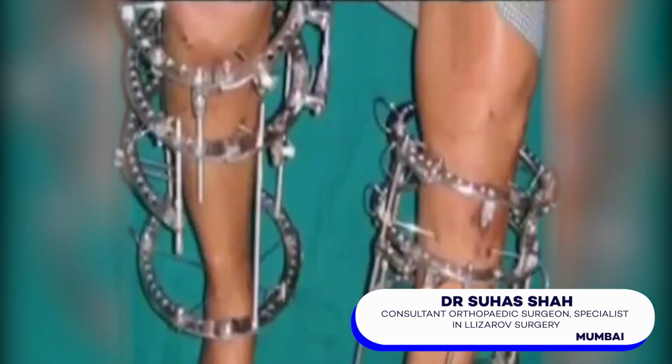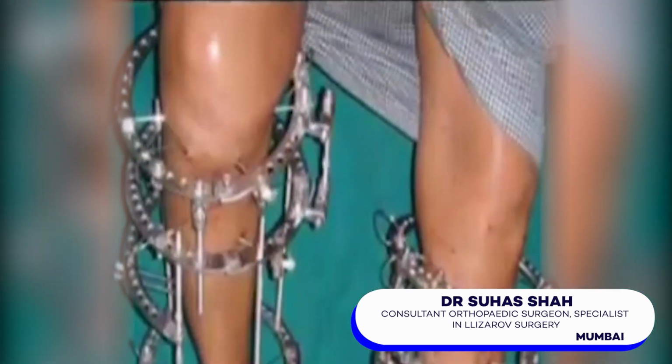How does Ilizarov fixator help in these deformities? By putting on the fixator, we can correct the varus deformity of the knee joint. By correcting the deformity, we are changing the loading pattern of the knee joint. Before the surgery, the patient is walking on the medial compartment, and after correction of the deformity, the patient is pushing the load on the lateral compartment.